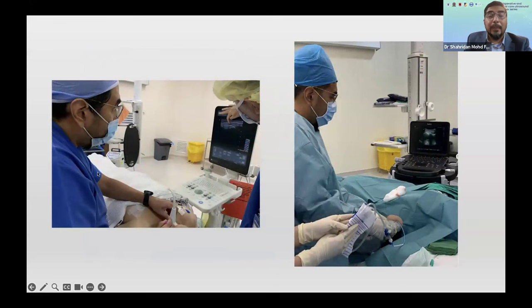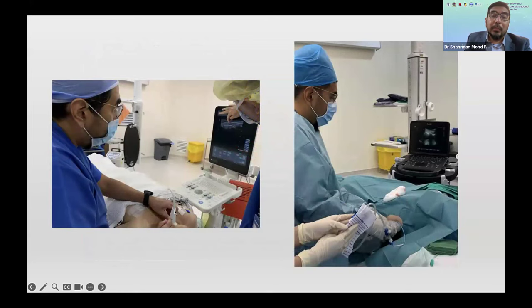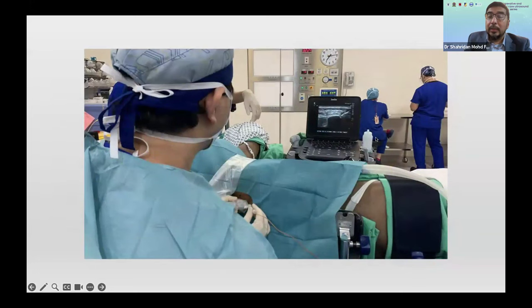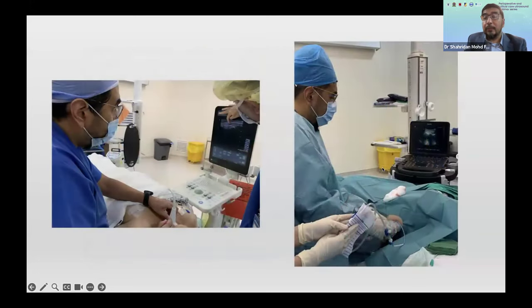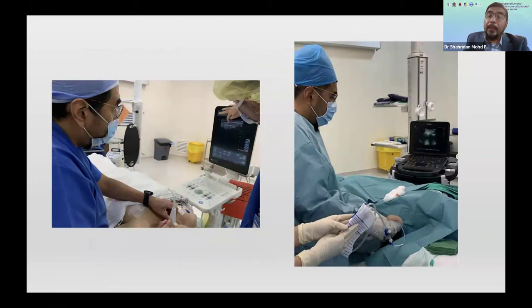This is myself assisting my ENT surgeon. The patient was planned for an actual formal tracheostomy, but he was having some difficulty palpating the neck, so I brought the ultrasound in and showed where the things are. And in this particular picture was myself doing a pleural drainage I was referred to do. I don't get this kind of referral anymore because we do have an interventional radiologist at the moment.